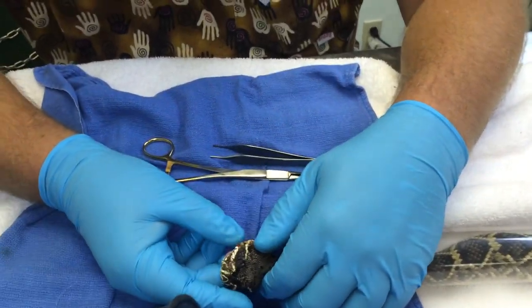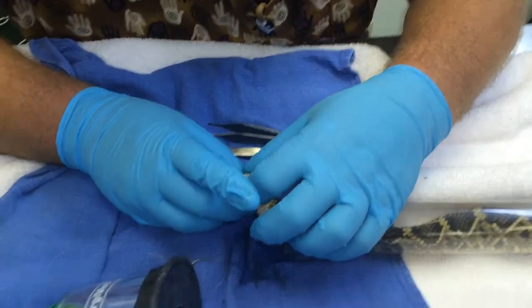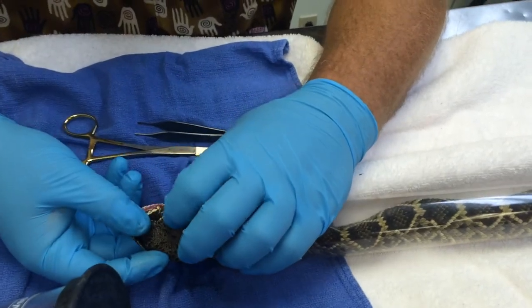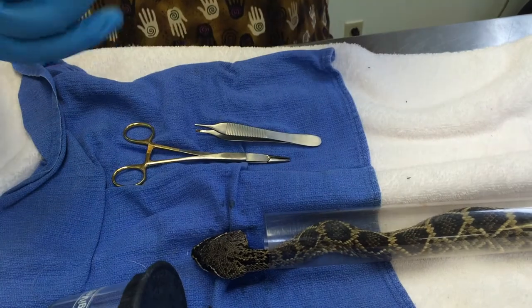That looks like it'll hold. We're a darn good team, Missy. Y'all are a good team. I'm so proud of y'all. We're the Wildcats. Oh, Lord. Y'all are going to get the dog. I'm going to put one more suture in there.